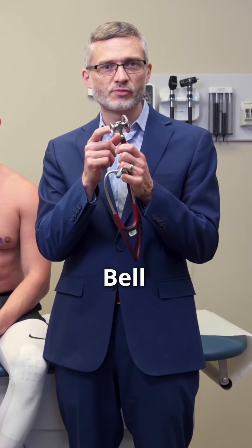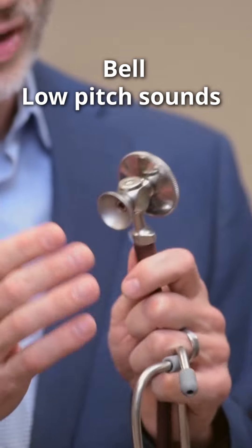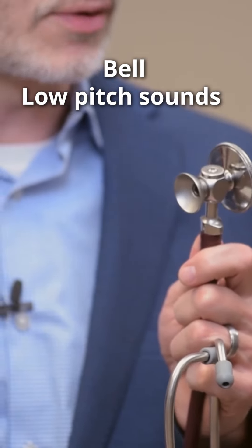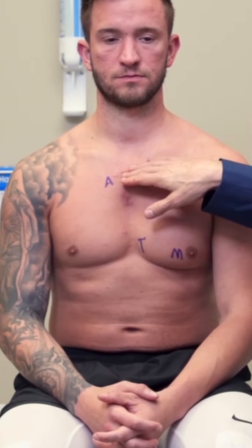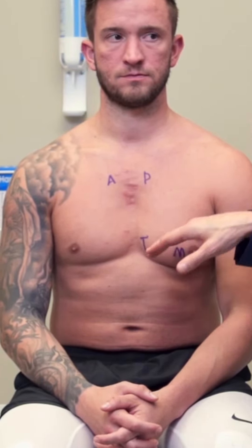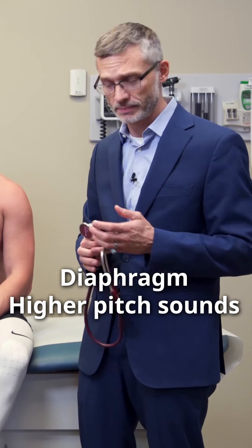The bell of your stethoscope is most useful for low-pitched sounds. By putting the bell on the chest and creating a seal, you are filtering out a lot of the higher-pitched sounds. Now we're gonna best hear S2 up here, we're gonna best hear S1 down here, and typically you're listening with the diaphragm because they're both higher-pitched sounds.